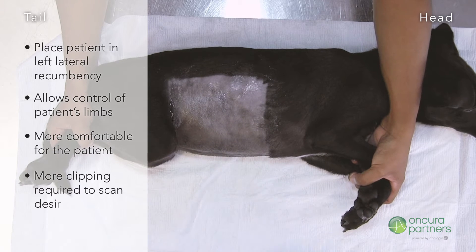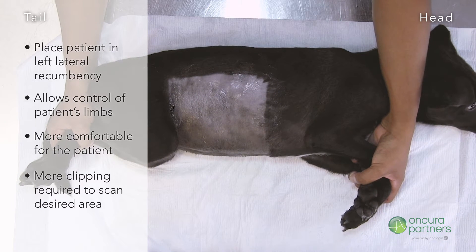For this position, clipping will be more generous to allow the sonographer to reach the desired area. This is something to consider when speaking to the pet owner.